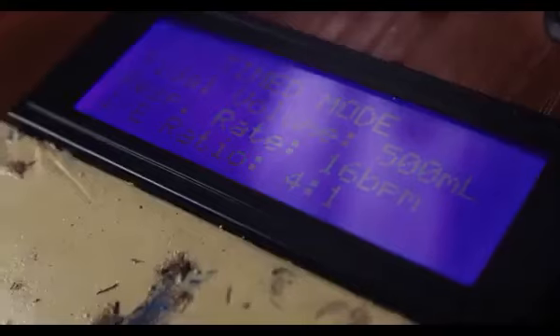One of the things that we are going to be doing in this video is a brief demonstration on how the system works, so you get to see the different parts of the ventilator and how it's being controlled, the functionalities basically.